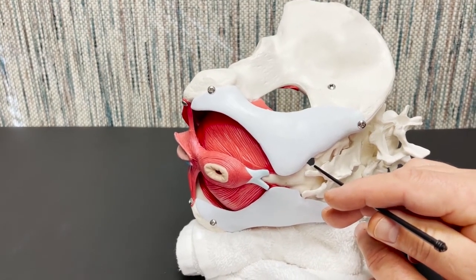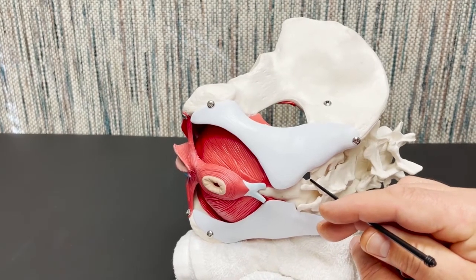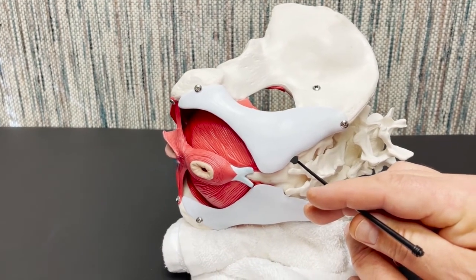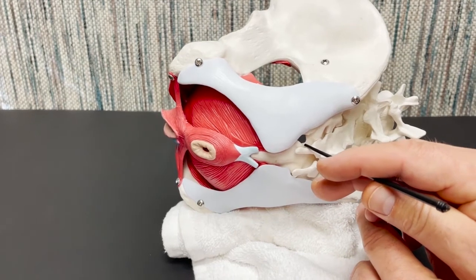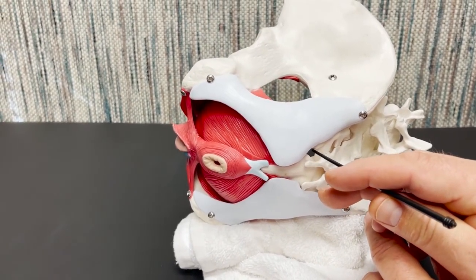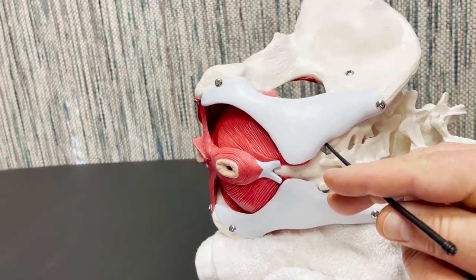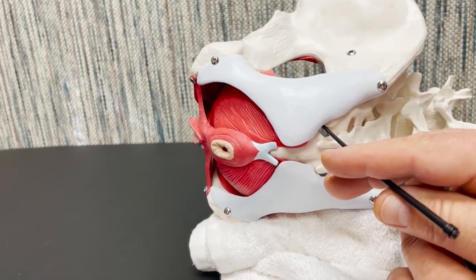Then we're going to move 1 finger breadth lateral until we feel the drop off of the lateral sacral border, and then we'll needle in angulation slightly lateral, no further than 1 to 1.5 centimeters deeper than our test needle was. So here we are, our test needle to determine what our depth is. We're going to move 1 finger breadth lateral, and we're going to angulate slightly laterally again and advance the needle no more than 1 to 1.5 centimeters further than that test position.